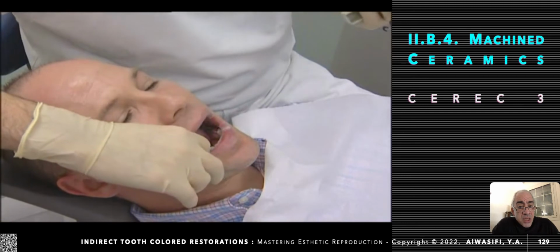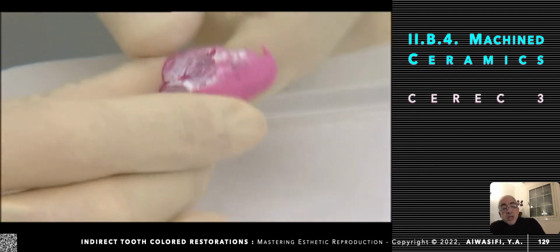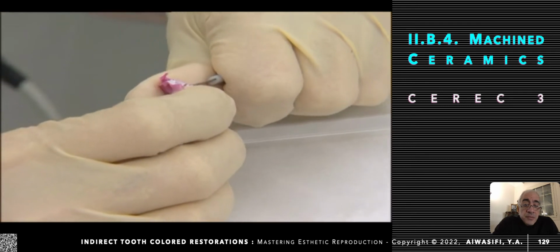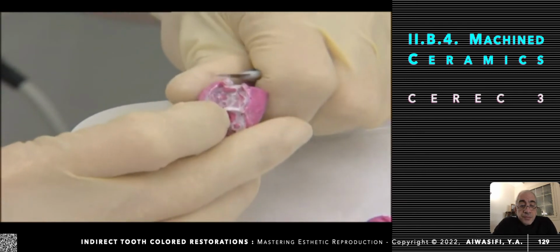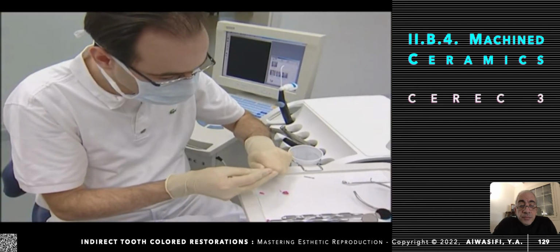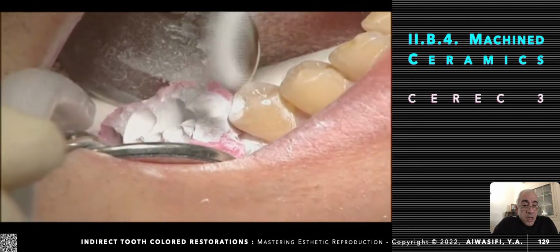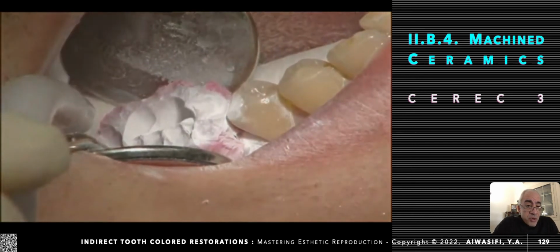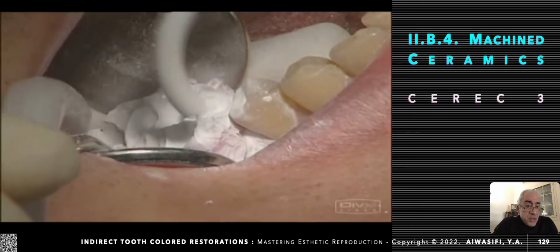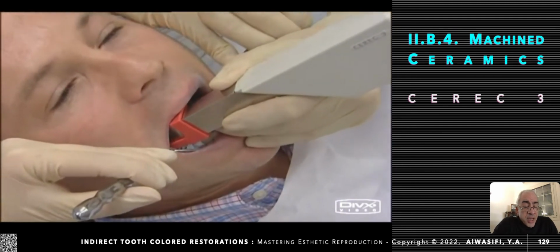Then he is now recording the occlusal relationship by using a special silicone jaw relation registration paste, cutting the excess. And now he is placing again his bite registration block into the cavity. Okay, spraying it also with anti-reflection powder, titanium oxide, and we'll get another picture of the opposing occlusion relation.